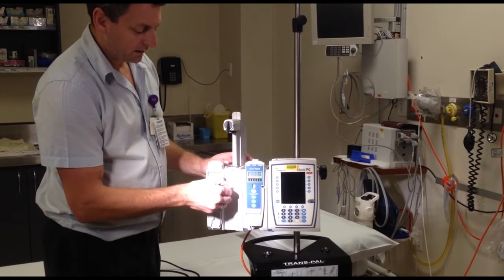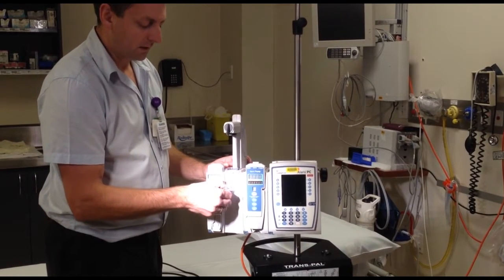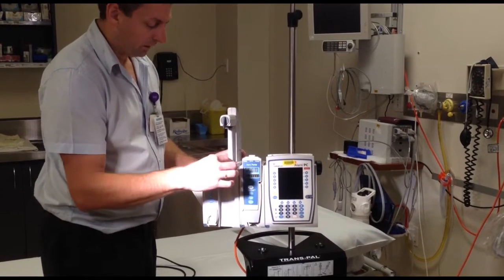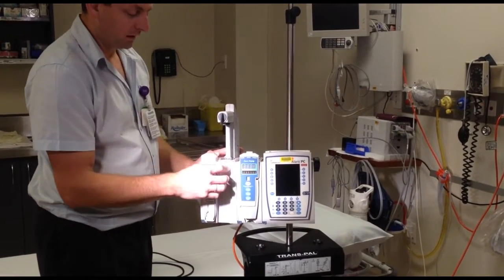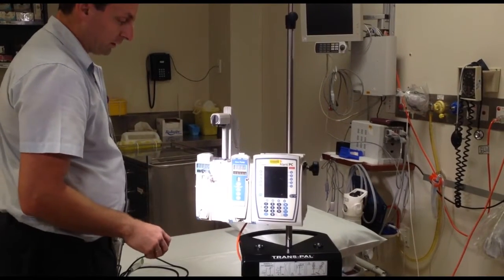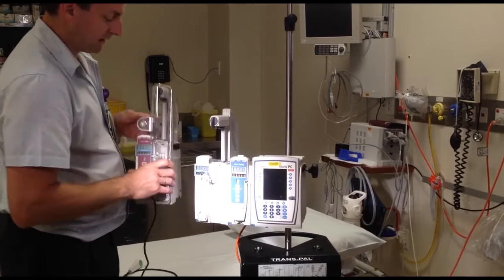It has a front guide here. This determines how big the syringe is, and also this little grey flap here holds the flange of a syringe, which I'll show you later when we load it up.